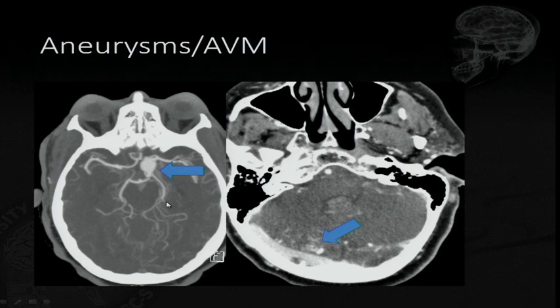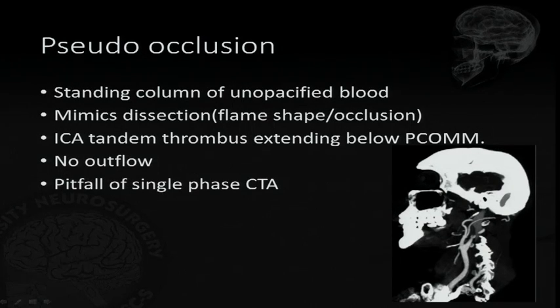Why the 10 millimeter? Because even though the global contraindications say aneurysm, there is a description, and they recommend that only aneurysms more than 10 are excluded. But again, that's going to be up to neurology. If you tell them there's a 2 millimeter aneurysm and they don't want to do it, then they'll just say, oh, there's an aneurysm. If you go to comprehensive centers, they'll give TPA to almost everyone.